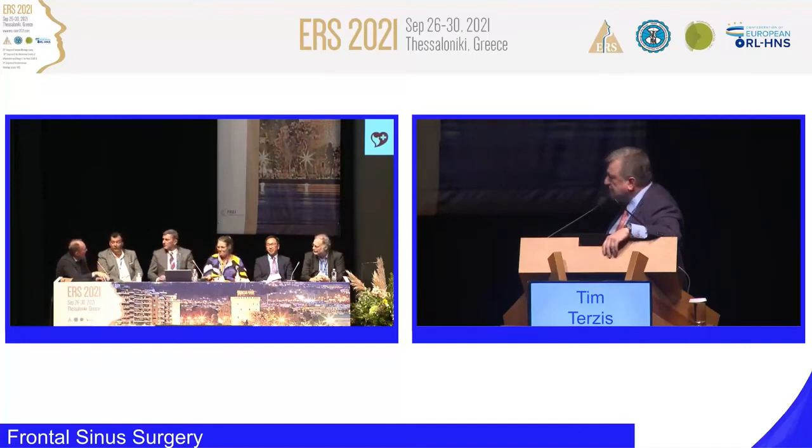Andreas? A good case, because you start first by thinking and then operating, or maybe not. I mean, do you have more scans? I would look at the anterior ethmoid cavity a bit more, because I have cases with an osteoma like this, and the problem was not the osteoma itself, it was more in the anterior ethmoid cavity, maybe. Is this the only scan you have? Do you have more? Yes, sorry, I haven't got more than this.